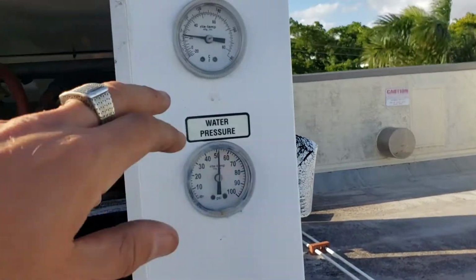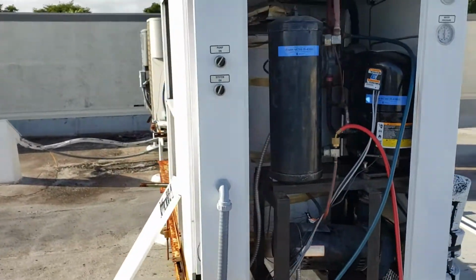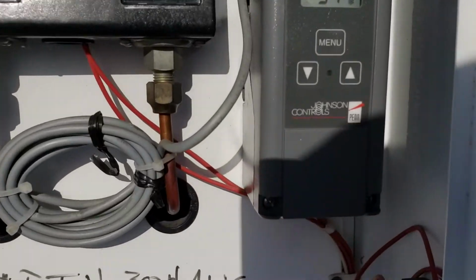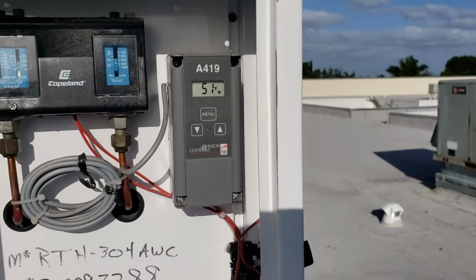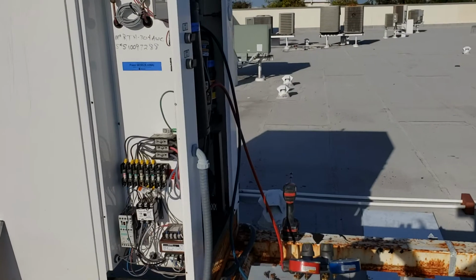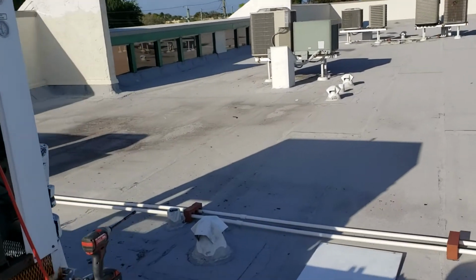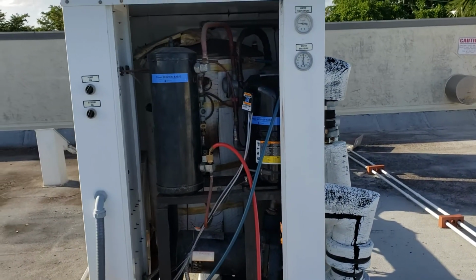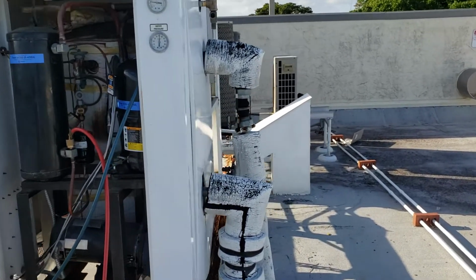This device over here is truly just not working. So as of right now, our chiller is operating, and we are at 50, and I just want to make sure it reaches its set point. Since they took the cold head off downstairs, I actually just connected the return side to the supply side for the inlet as a loop on the spindle that indicates water flow, so that we can actually run this test here so that I can do this startup.